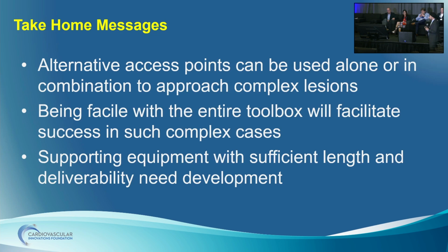Yeah, so this was right before Alluvia came out, which is why we used Supera. We didn't use Zilver. And the other issue is that the Supera is on an 018 and the Alluvia is on an 035. And sometimes coming retrograde, the Alluvia's had a little bit of a hitch for me, because again, we had to deliver everything retro. So that was the other consideration. But certainly I think Alluvia could have really been used in this situation probably.